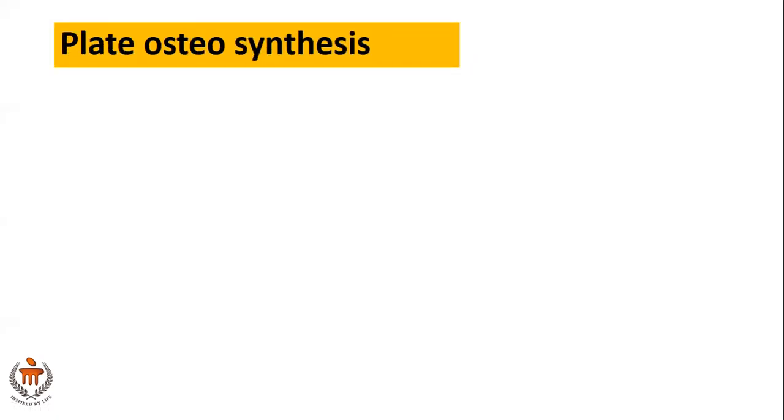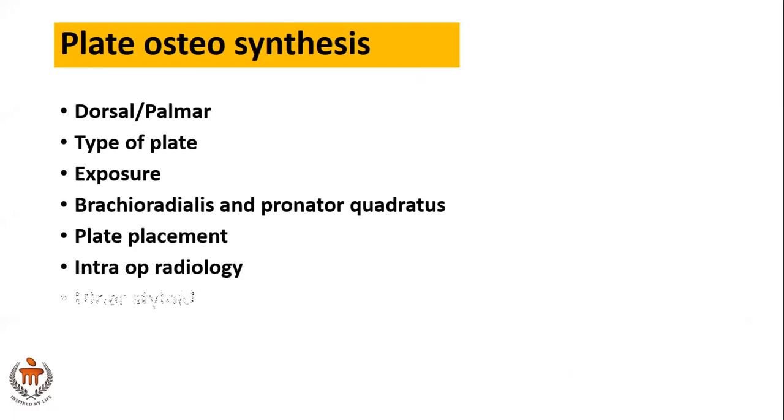But once the plates came in, I think there was a paradigm shift in terms of using them much, much more. Again, probably the cycle will go back, but right now, all over the world, most of the time the most sought after implant would be a plate. So there are various things you need to think about when you start using the plate: which type of plate, where it is to be placed, what the exposure is, and what you do intraoperatively. I'll just run through that quickly.